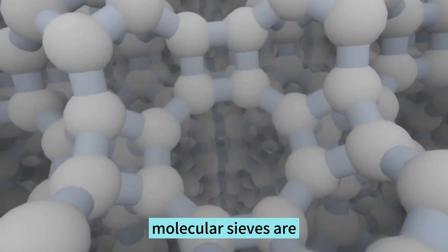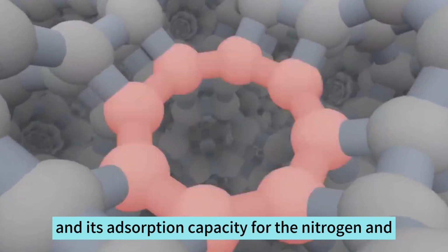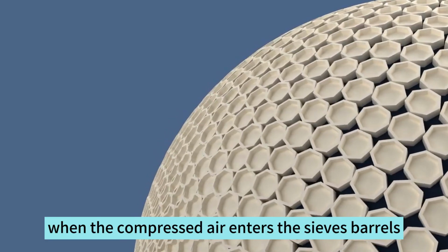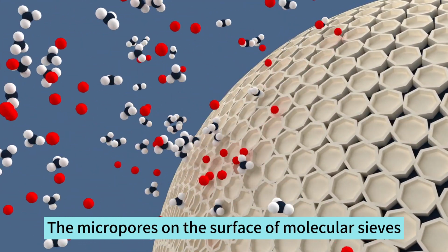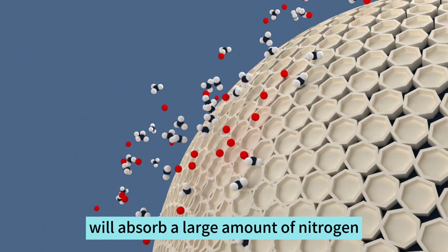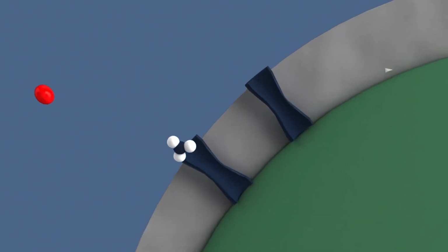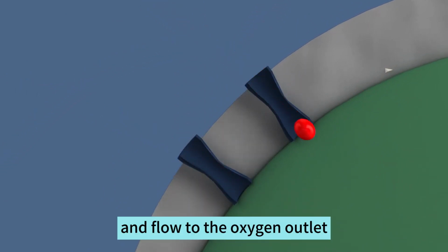Molecular sieves are zeolite porous material with a large surface area, and its adsorption capacity for the nitrogen and the oxygen are quite different. When the compressed air enters the sieve barrels, the macropores on the surface of the molecular sieves will absorb a large amount of nitrogen and let the unabsorbed oxygen pass through. Then the oxygen will stop in the oxygen tank and flow to the oxygen outlet.